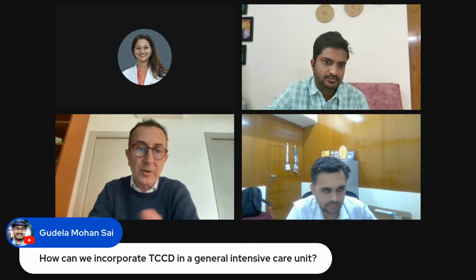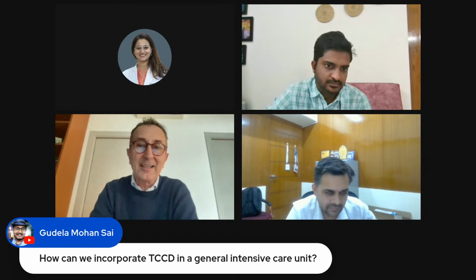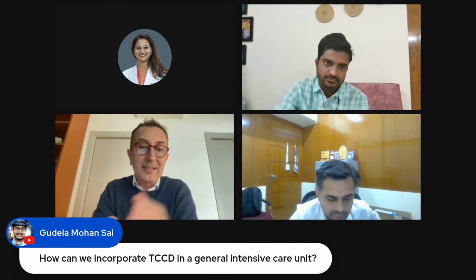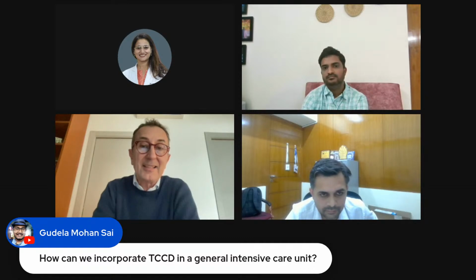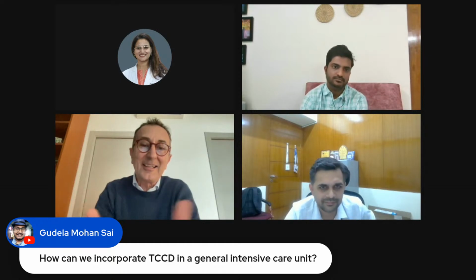This is another example, how this is not TCCD, but ultrasound. It's a point of care ultrasound. And so point of care in ICU maybe the midline shift, or the other monitoring. This is the victory of TCCD, the capability of monitoring. Definitely, sir. In every setting, also in emergency room.